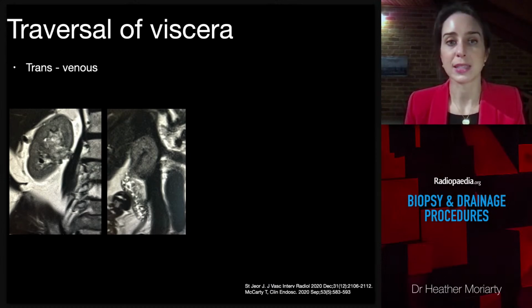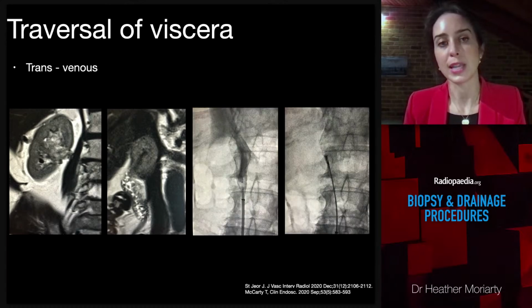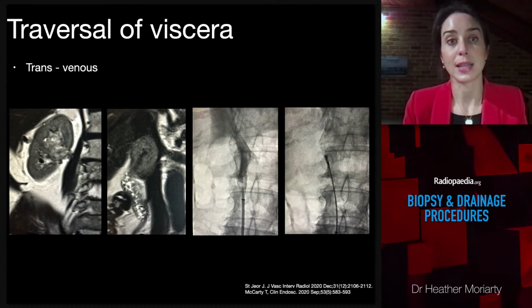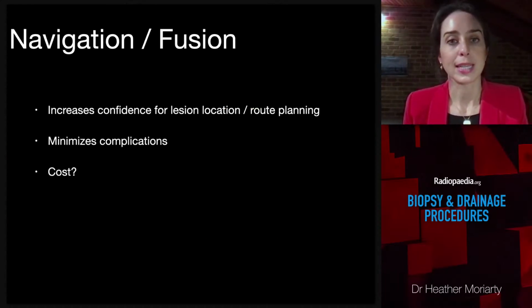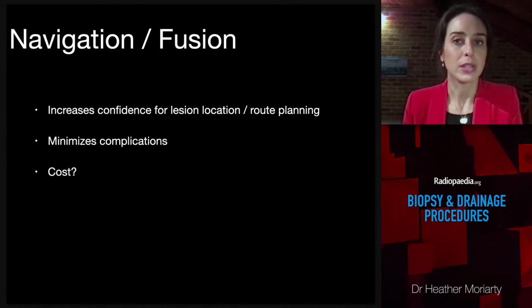This is a renal cancer, which is high risk for a percutaneous biopsy because of the medial lesion location, but it was easily accessible by a transvenous approach. Navigation and fusion techniques can help a lot if they're available to you, particularly for challenging lesions.